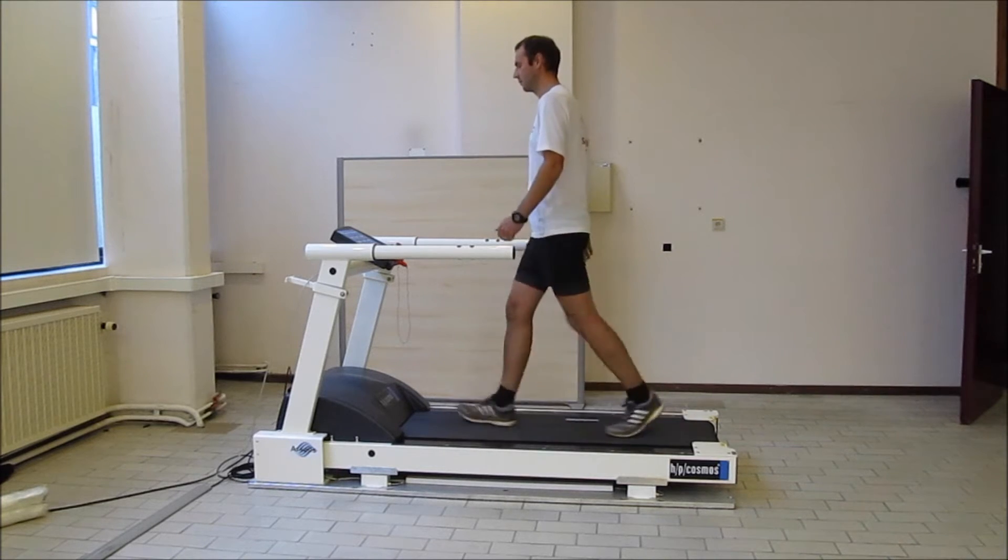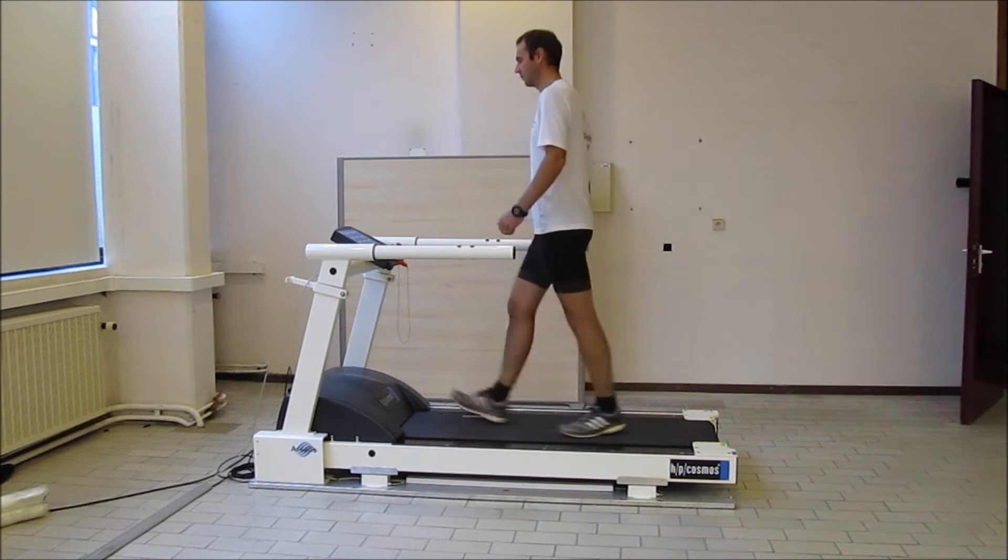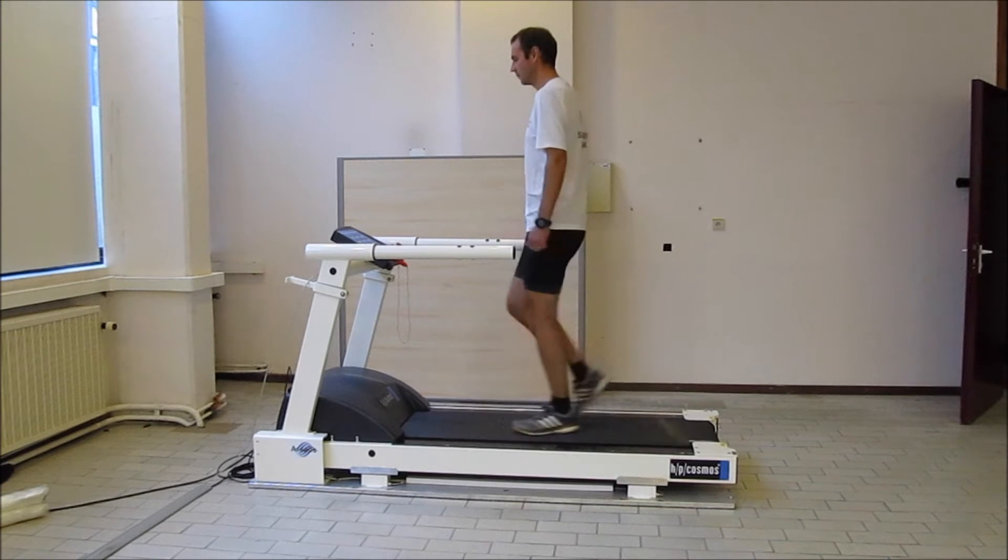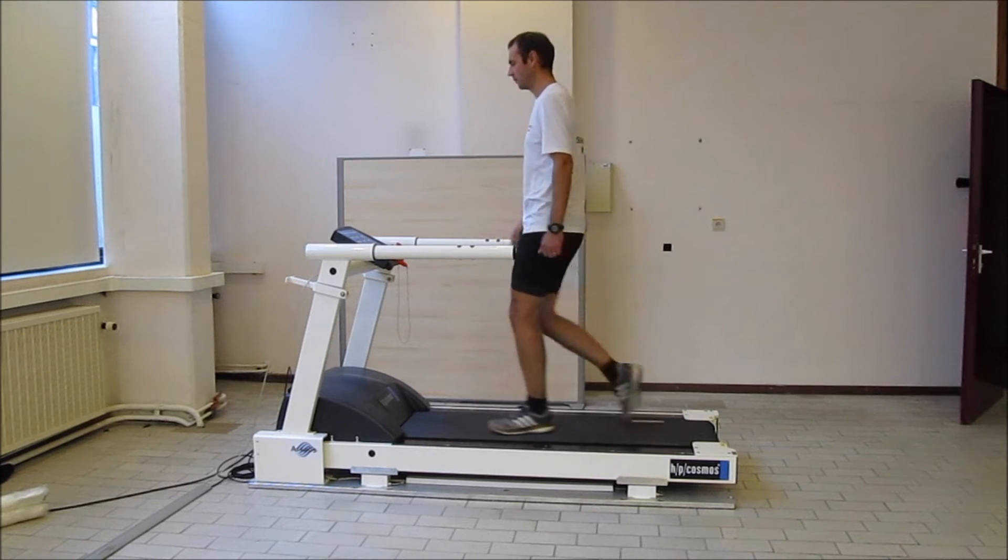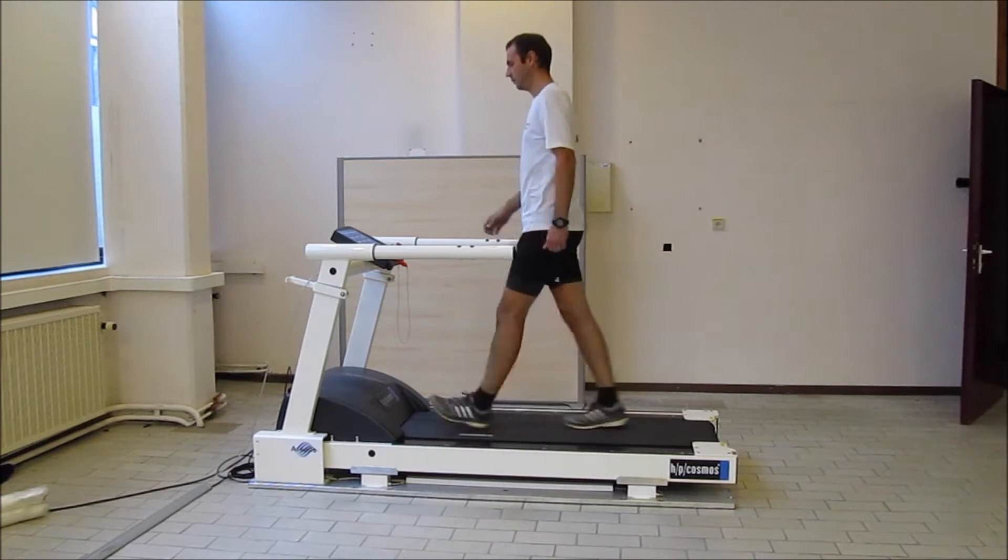The vertical force is computed for the left and right foot, and multiple steps can be superimposed to evaluate gait asymmetry.